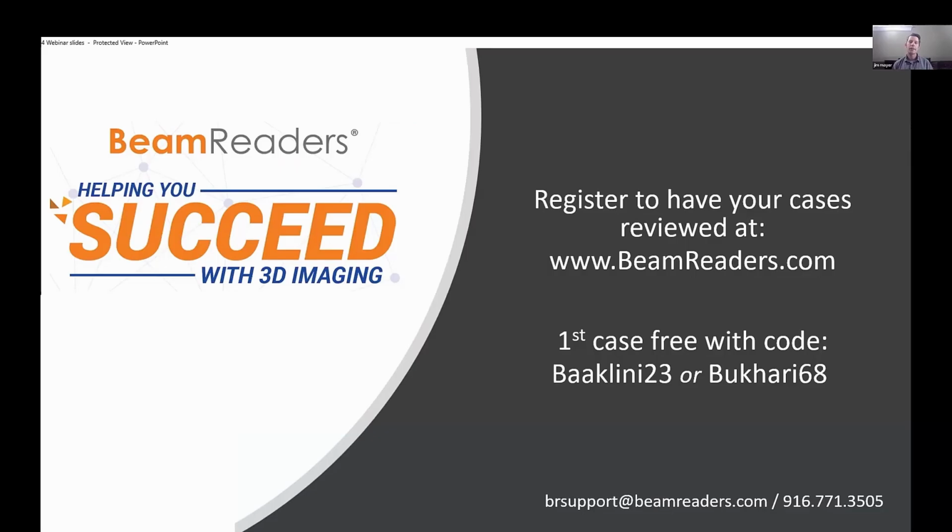I want to thank everyone for attending today, and for your interaction with us. Dr. Boccolini, Dr. Bukhari, we covered a lot of material. I think we touched on a lot of the objectives, including understanding and interpreting artifacts. We talked about motion and beam hardening. We should have gained some proficiency in examining lesions from all different dimensions. I think both of you took us through those.